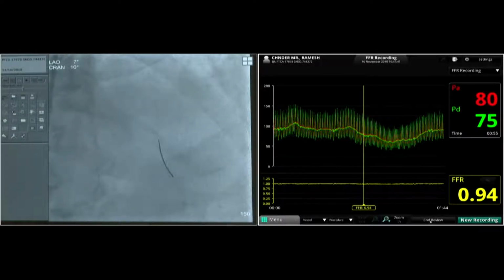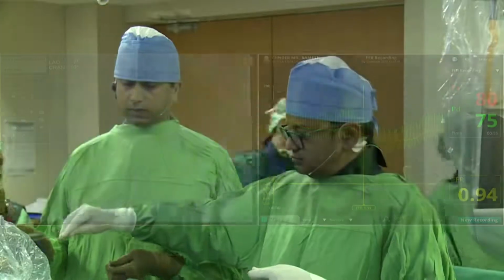But nonetheless, we will again post dilate the proximal end with 3.5 into 13. We will go on the FFR wire itself. I think that's totally reasonable, and then you're finished. This is what our hypothesis is going to be, to have it greater than 0.9 and see what that means with patients less than 0.9.